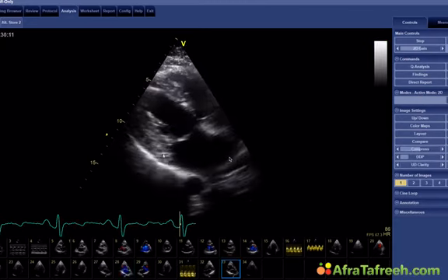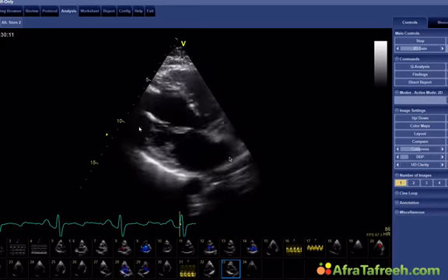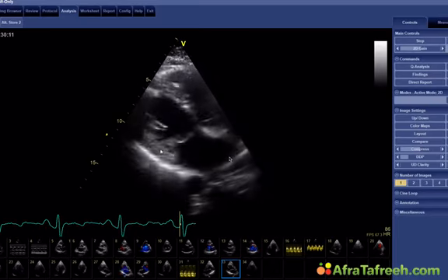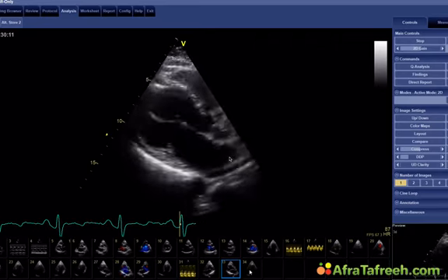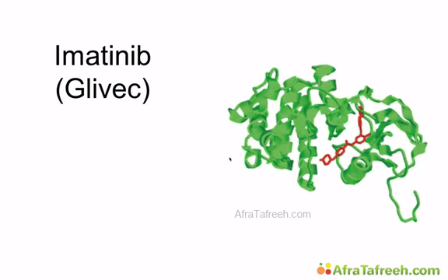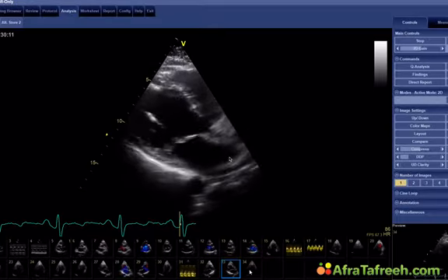Okay, so here you can see the mitral valve, and we think that the endocardium was not only affected here in the apex, but also on the mitral valve, and that there was some degree of fibrosis, which led to this mitral regurgitation, which was at least partially reversible. So everything was fine. We were very happy. However, the story continues. After some time, the patient came again with mitral regurgitation.